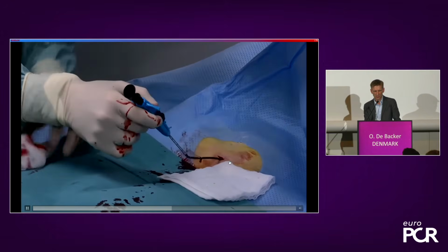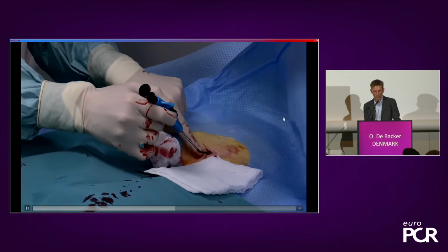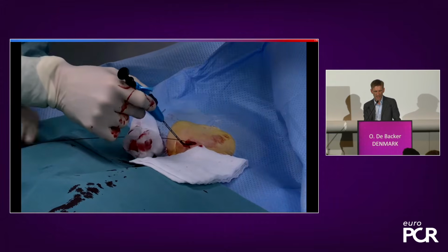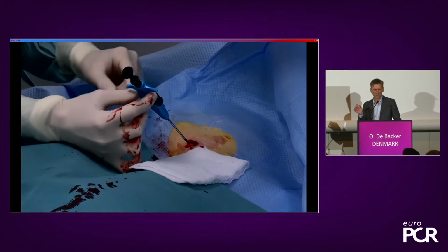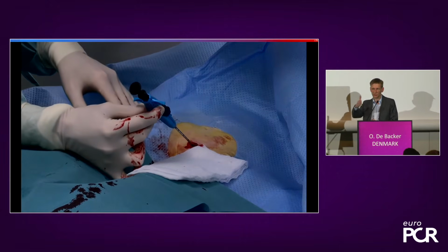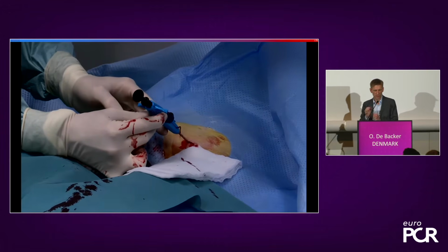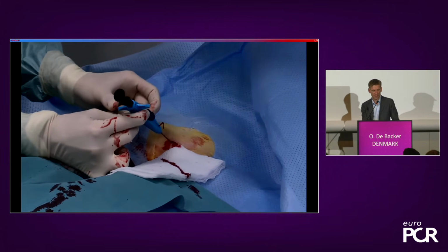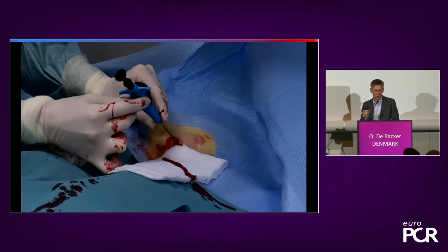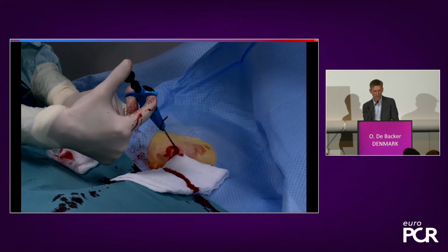You will see that. So we introduce it, we bring it forward into the vessel. This is now the moment to pull out this wire. So now I will be pulling out this wire. And then I take this Prostyle at 45 degrees nicely into the axis of the artery. So don't do it at an angle. Try to imagine where that artery goes and try to introduce it at 45 degrees. If you have bleed back, now is the moment to pull back, bring the lever up. Yes, pull back, and now I shoot the needles.